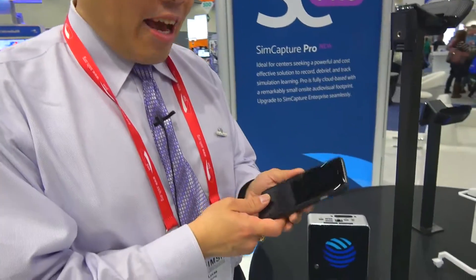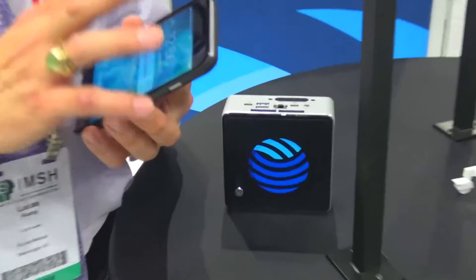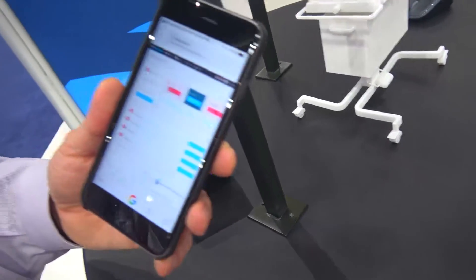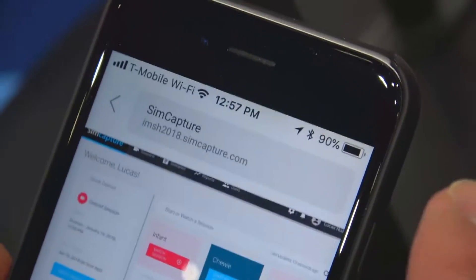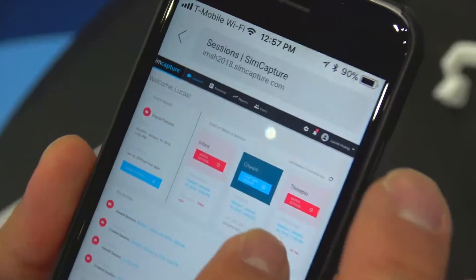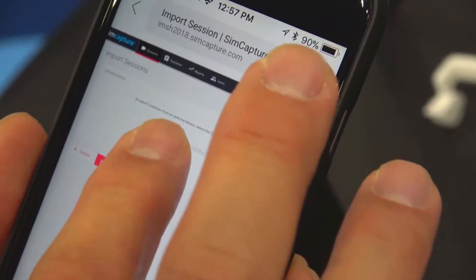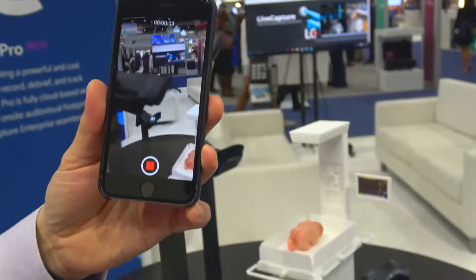The beauty is that you can also do it on your cell phone. We also have the option where you can now record directly from your phone and upload directly into SimCapture Pro. You can log into the cloud, and it has all the functionality within here that you can see from the main system. You can record directly from your phone, take photos from your camera, and record from these pieces wherever you want.